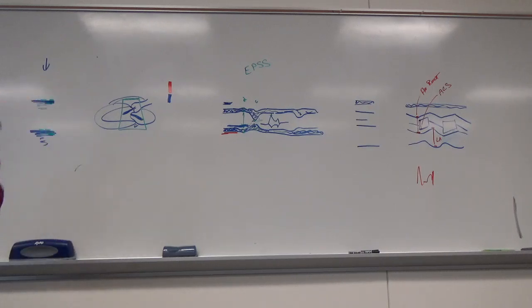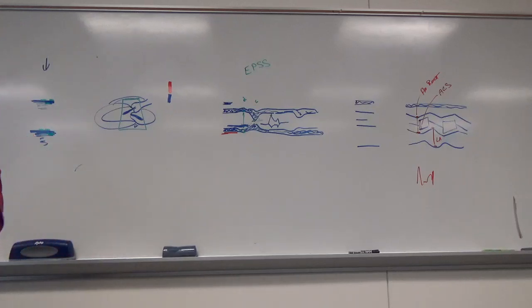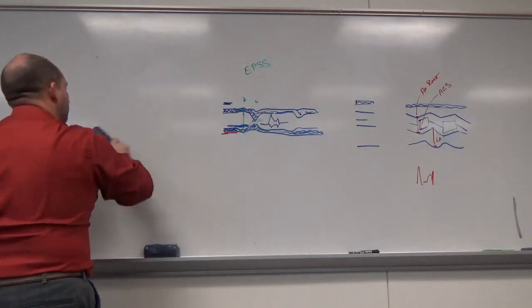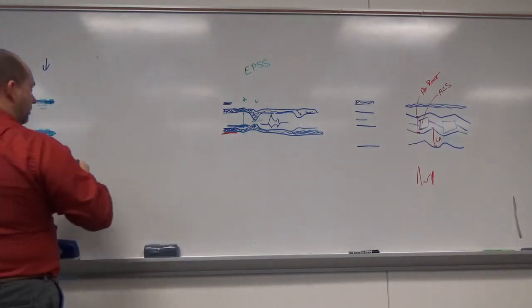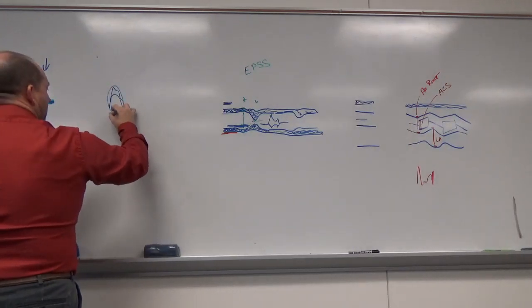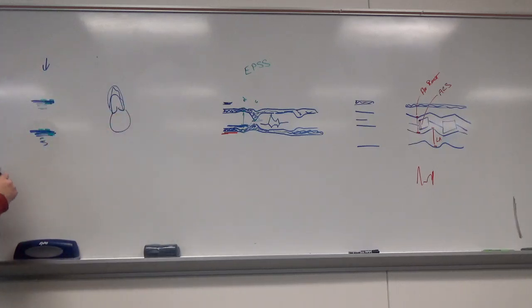So that's that view. The next view we go into is the tricuspid valve. That one we simply do, we don't need to measure anything in 2D, so we take a 2D clip, then we take a 2D in color, looking for leakages in the valve. Okay, remember, the tricuspid valve points up into the ventricle.